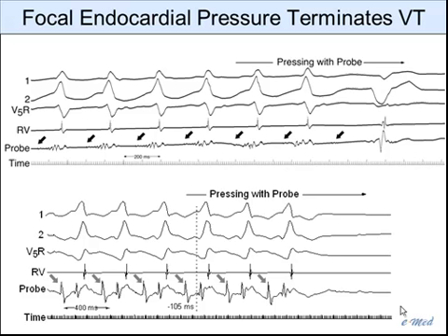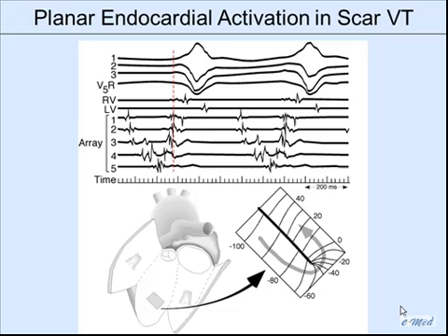And this is such a small electrogram, you have to have arrows to help you out. Here's a larger electrogram here. And in this case, the impulse gets past the diastolic electrogram, then fails. In this case, it fails before the diastolic electrogram. And we used to do this all the time in the operating room.